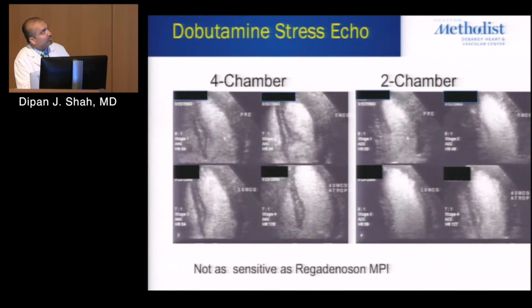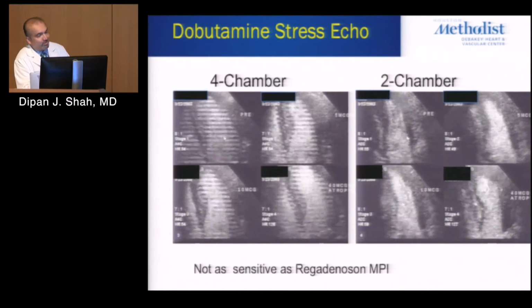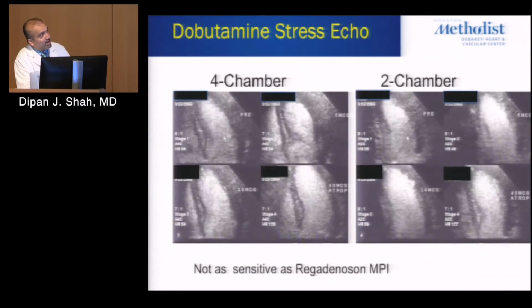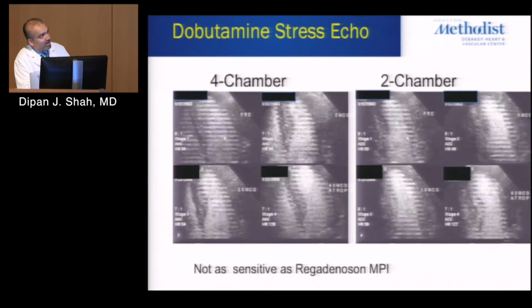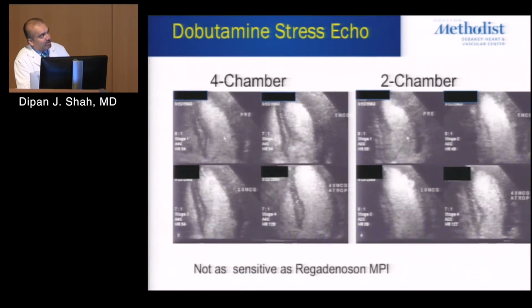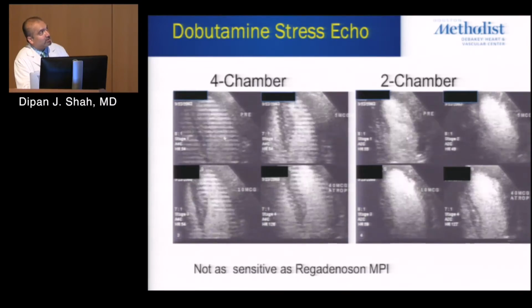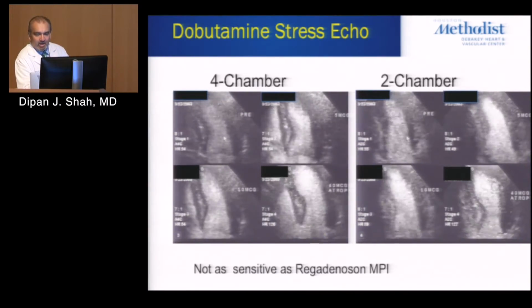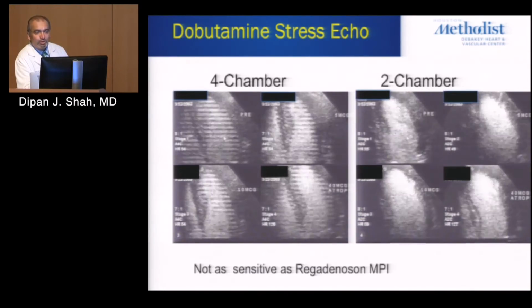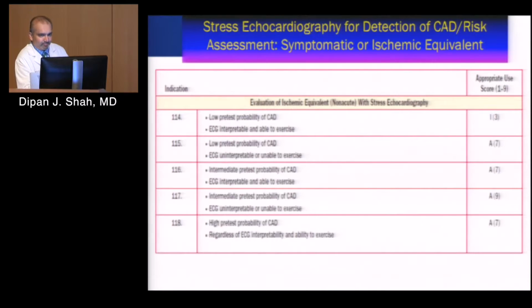And you can see that both on the 4-chamber view, which is showing us the septum and the lateral wall, or if we look at the 2-chamber view here and focus in on the apex again, this is showing you the inferior wall and the anterior wall. And again, you can see this abnormality here where the apex looks like it's ballooned. It's gotten bigger actually during systole than it was before. So this is an abnormal finding, indicative again of inducible wall motion abnormality suggesting coronary artery disease in this patient.